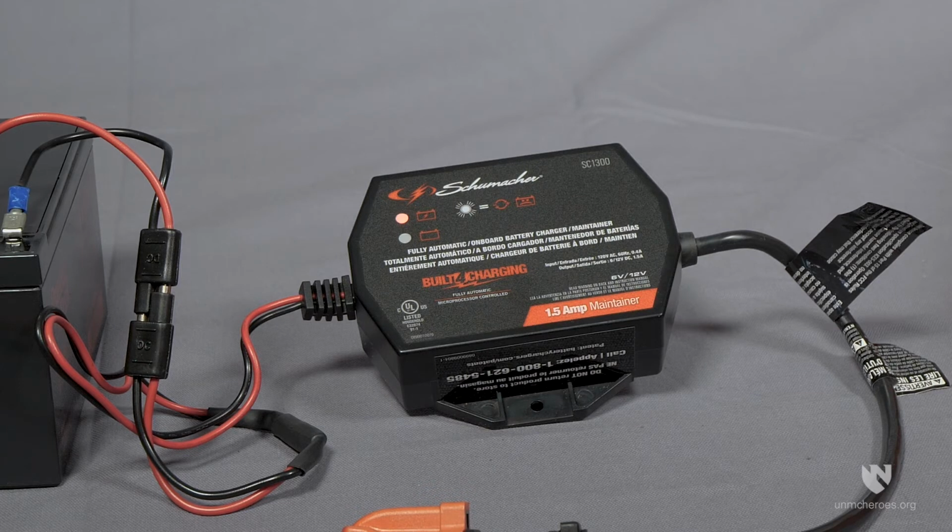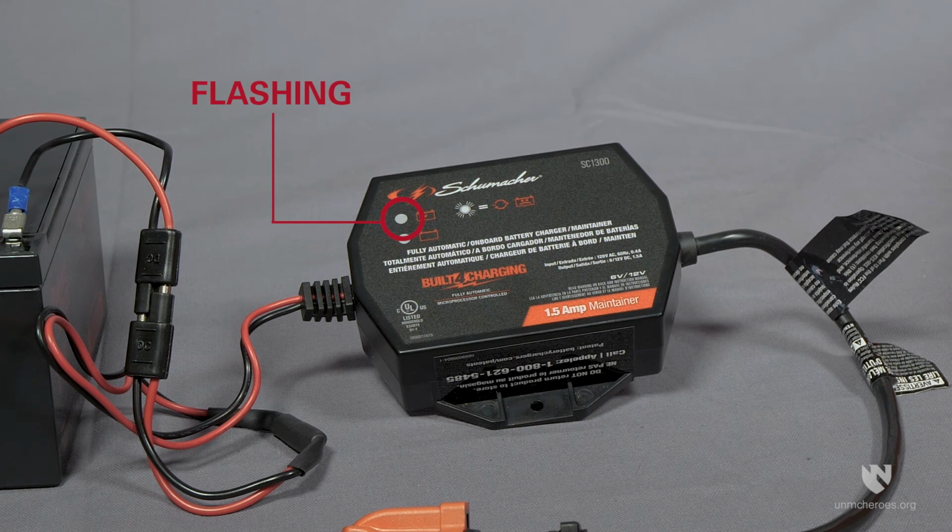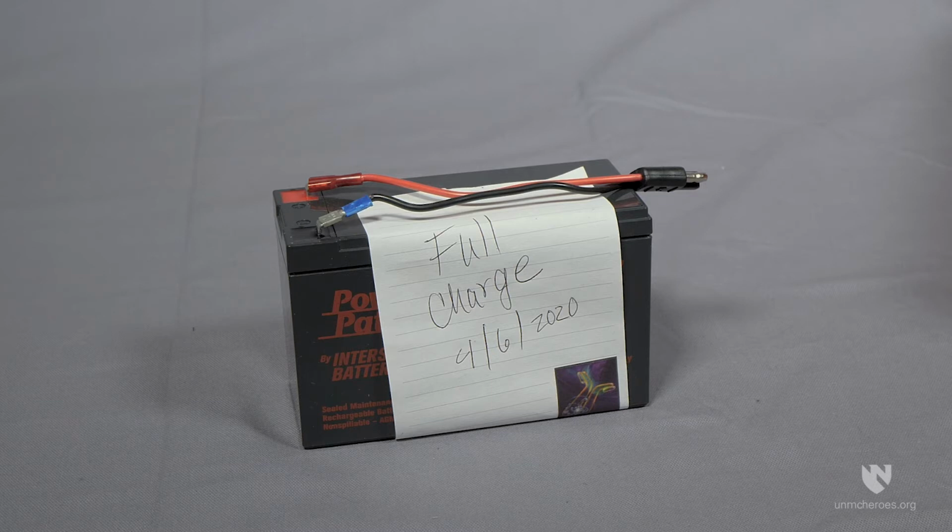Check the battery for a full charge using the battery charger. The LED light will be red when charging. At full charge, the LED light will change to green. If the light is flashing red, this indicates a bad battery. The battery charger is fully automatic and switches to maintain mode once a full charge is reached. Consider keeping a log or using a sticker to indicate the last date the battery was charged.